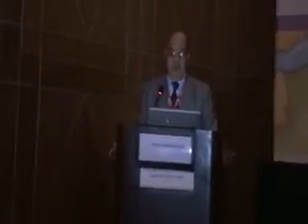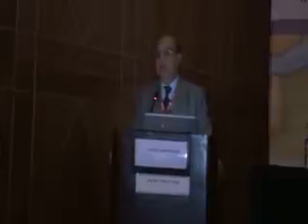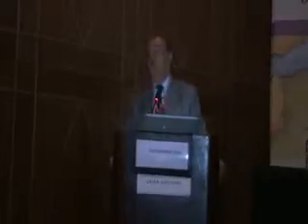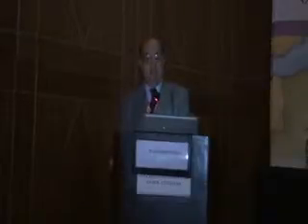A good thing is the robotic tracking system using the CyberKnife. The CyberKnife is tracking the patients using a robotic arm as well as a robotic table. And in this you can decrease the fractions of the treatment from 38 fractions to a few fractions like 6 or 8 fractions because of the very high accuracy rate.